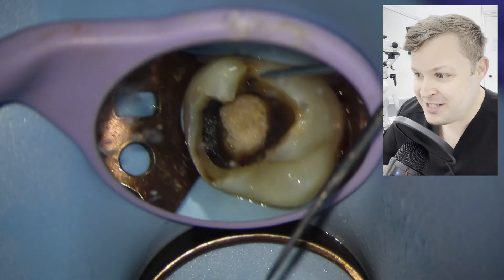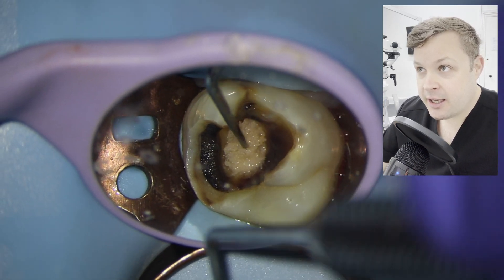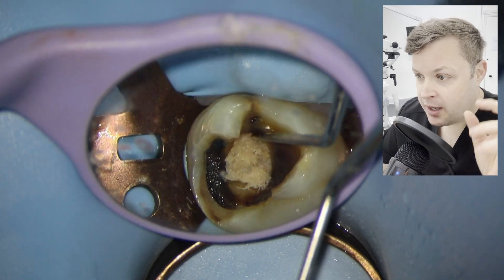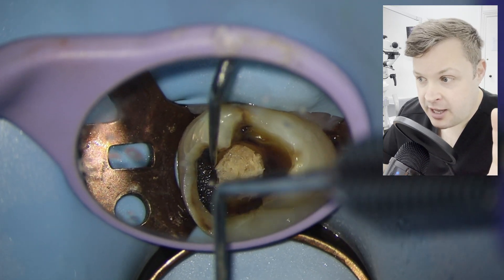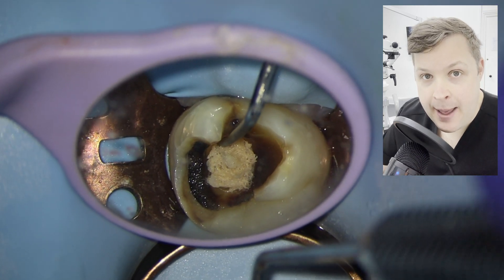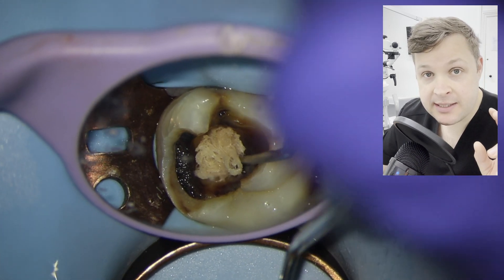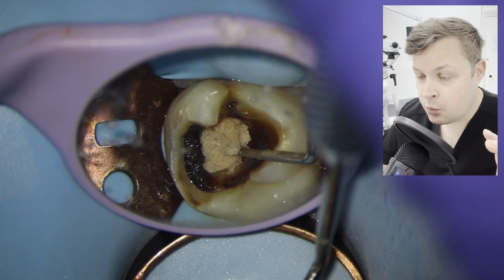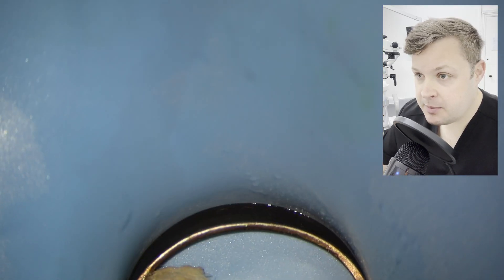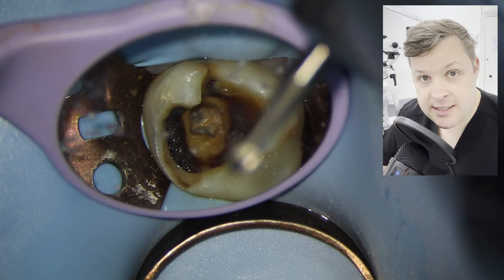Hello, welcome today. This video is going to demonstrate how to open up a tooth, access a tooth, find MB2 and shape MB2. Today we're not going to finish the case — this case is going to be dressed and ready for obturation at a later date.